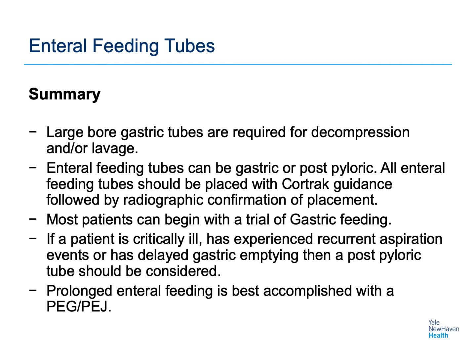One last note about both types of tubes is they are both meant to be short-term solutions. Neither a nasogastric tube nor a nasoenteric tube are meant to be placed in a patient for longer than days to weeks. So if you're concerned that it is going to be a long-term issue for the patient, then we should be having that discussion as a care team and with the patient and their family about long-term solutions.